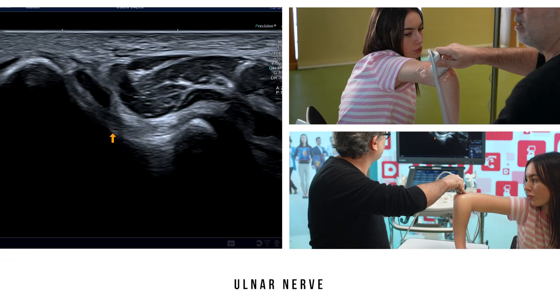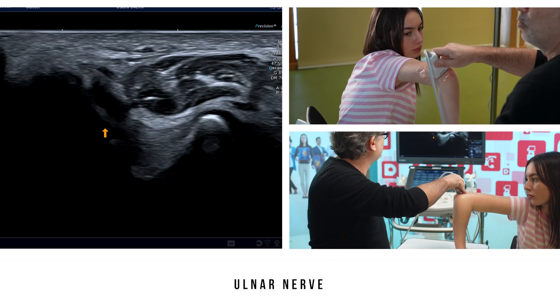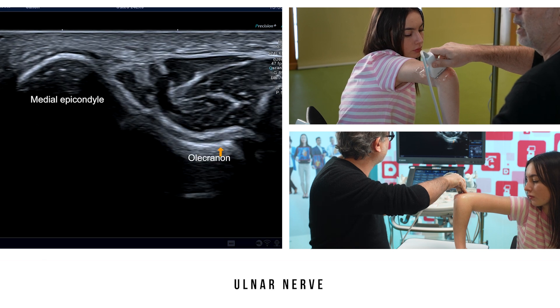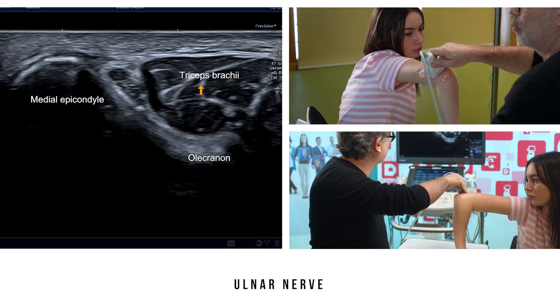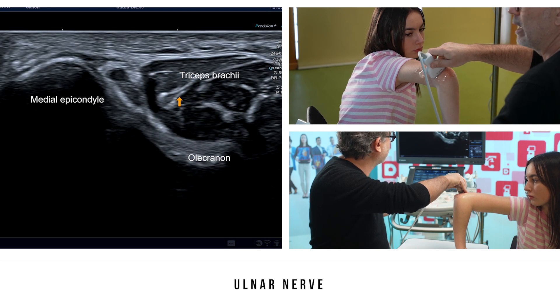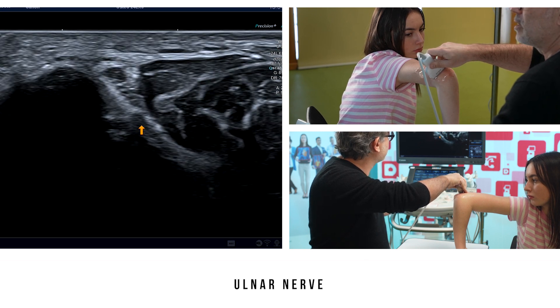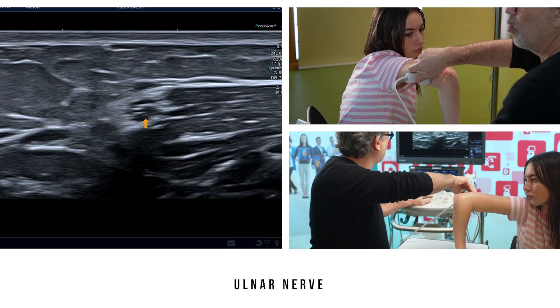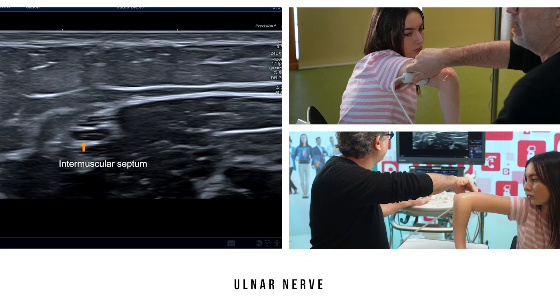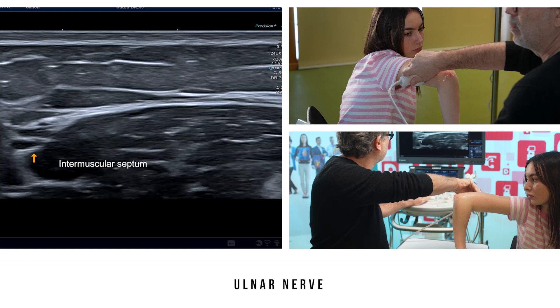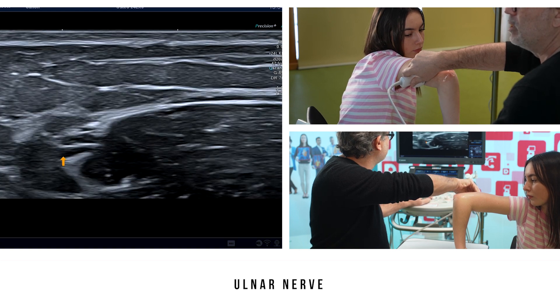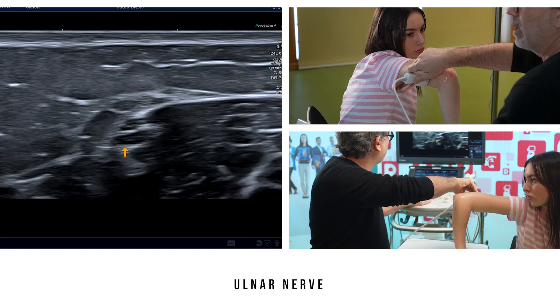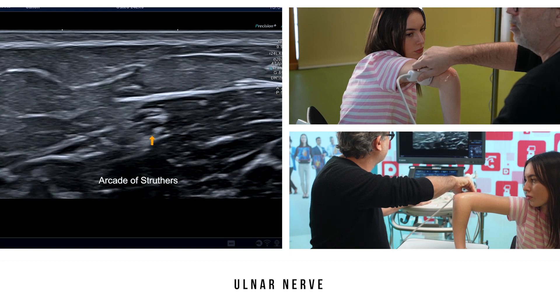The ulnar nerve is analyzed using an axial view at the olecranon fossa. It is interposed between the epicondyle and the olecranon, and closely follows the medial head of the triceps brachii. By using the elevator technique, we can follow it in the arm up to the intermuscular septum. It can be compressed at this level — six to eight centimeters above the olecranon — by a fibrous band called the arcade of Struthers.